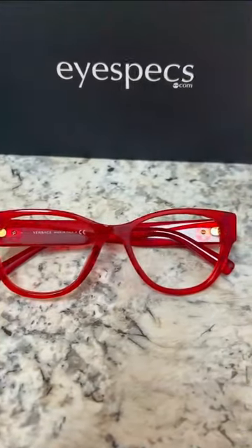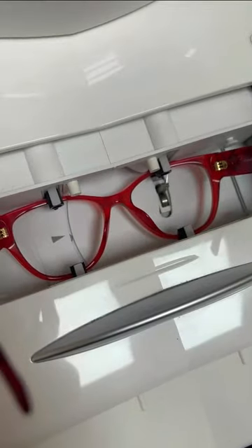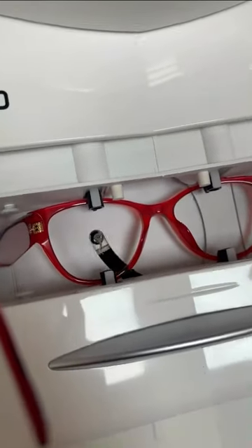Here we have Rachel's beautiful red Versace 3281-B women's eyeglasses. Rachel got clear polycarbonate lenses with an anti-reflective coating.